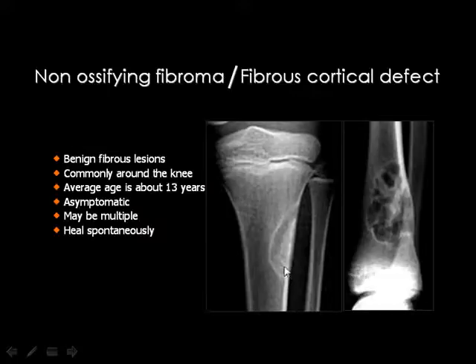If it did not fill or heal, it will turn into what's known as the non-ossifying fibroma. But actually, the books usually write the diagnosis like this: non-ossifying fibroma, fibrous cortical bone defect, because both are intimately related, and sometimes you cannot discriminate both lesions on the basis of radiology. I assume that whenever the lesion is like this one with no deformity of the bone, you may assume this is a fibrous cortical bone defect.